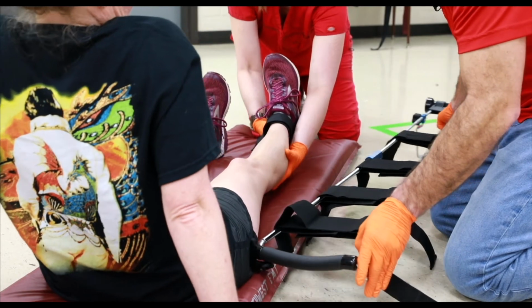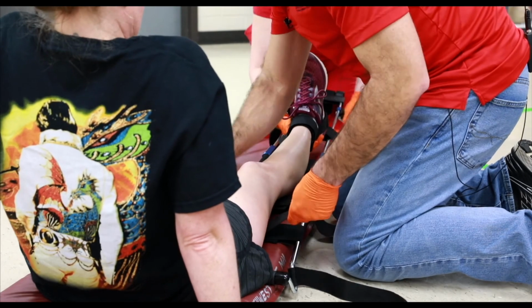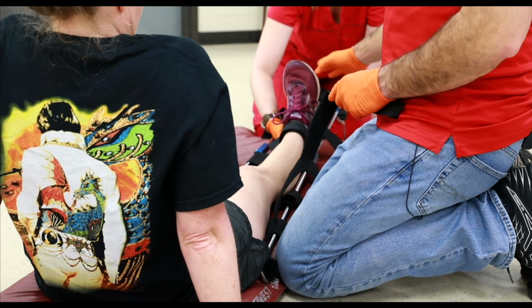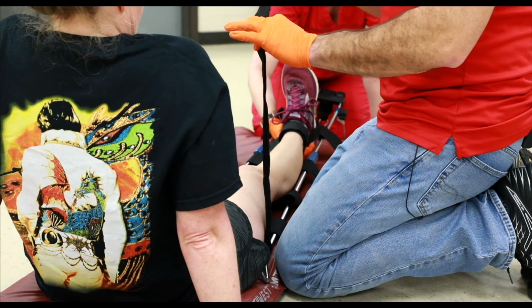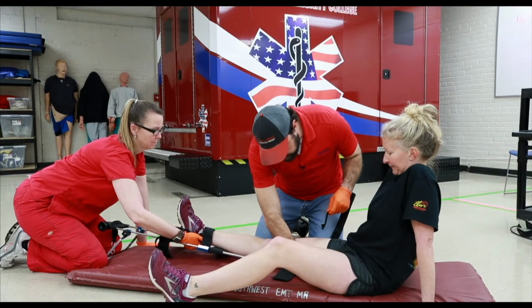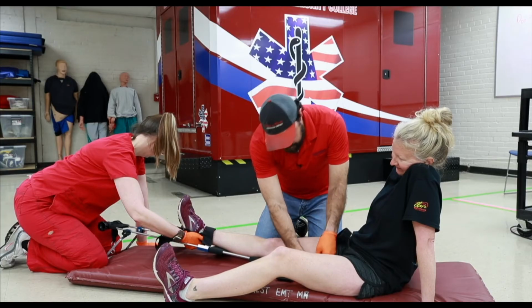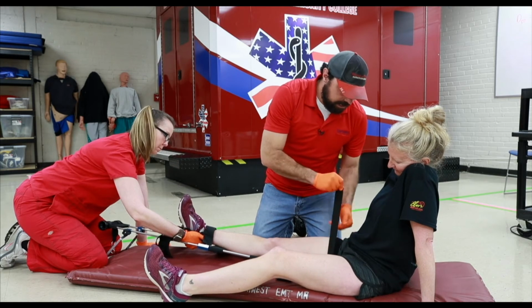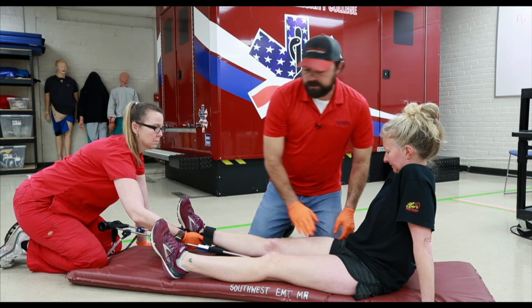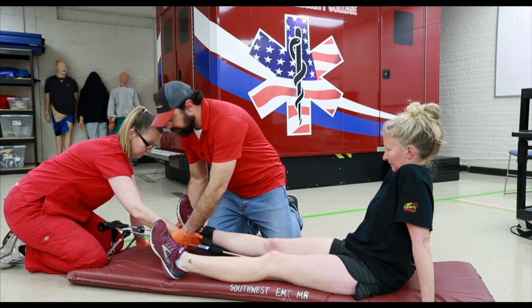1, 2, 3. I can tell you your patient will probably yell just a little bit. They're not going to be too happy about that for a second once you get that into place. And with this person still holding manual traction, you're going to put your ischial strap on. That's your strap that goes up right here in the groin area. This will be your first strap you have to place. Sometimes you got to get in tight. Sorry about that. It is what it is. You want to make that nice and snug. The reason why you need to place this on first before you do traction is because obviously you start to pull traction. That's not in place. The whole splint starts to slide.